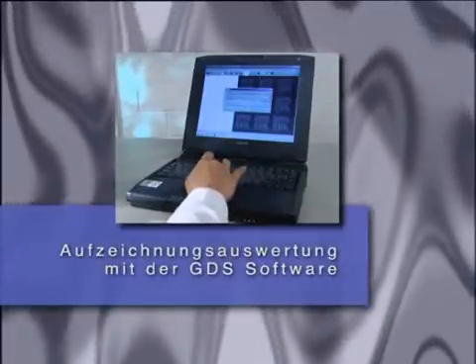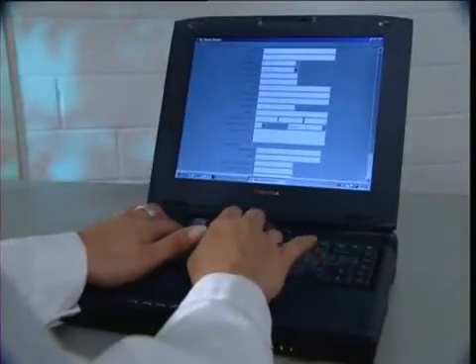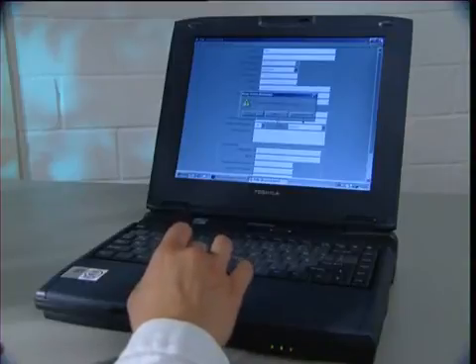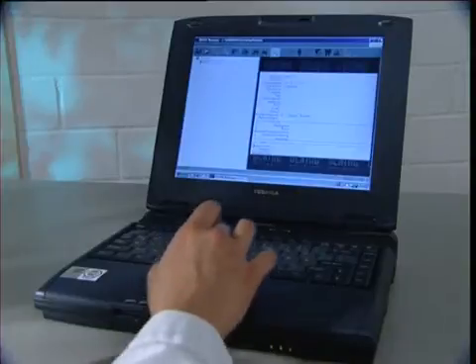The GDS software re-records all registered data for long-term electronic storage. This allows evaluations to be repeated, including the time factor and in 3D. The electronic box is connected to the PC and the GDS software activated.